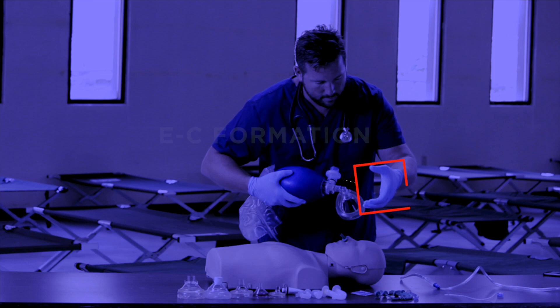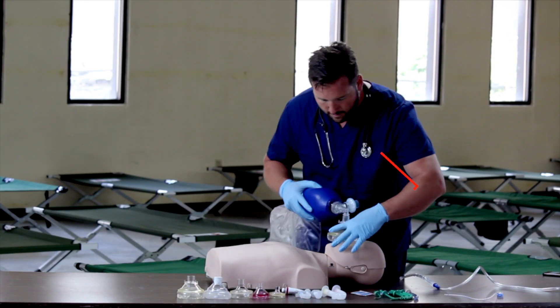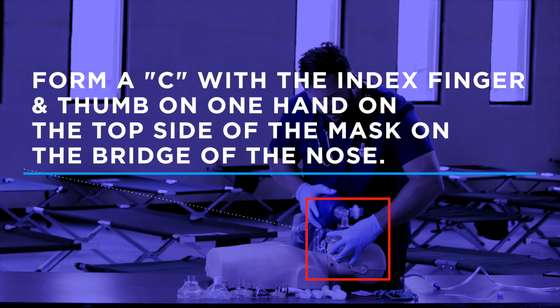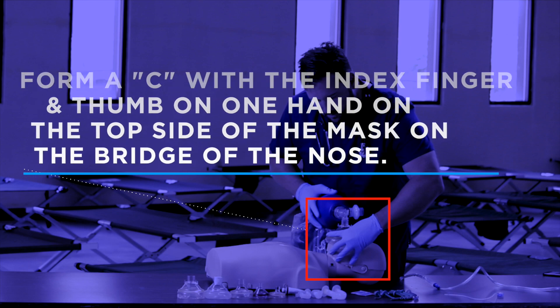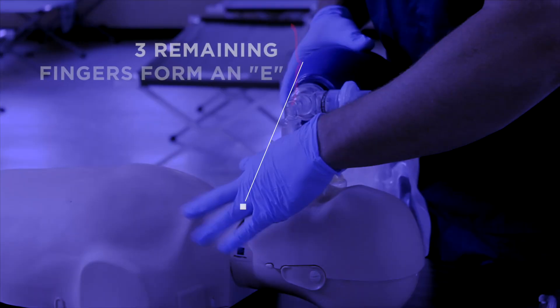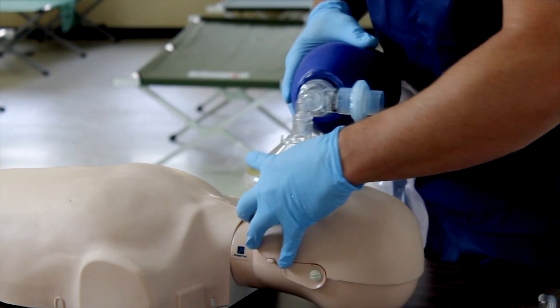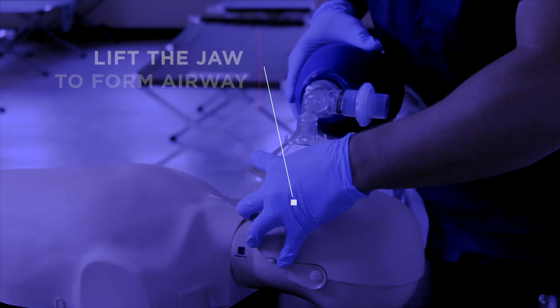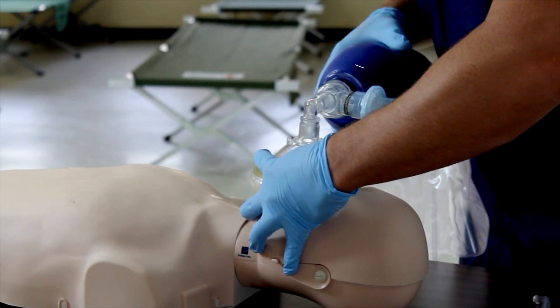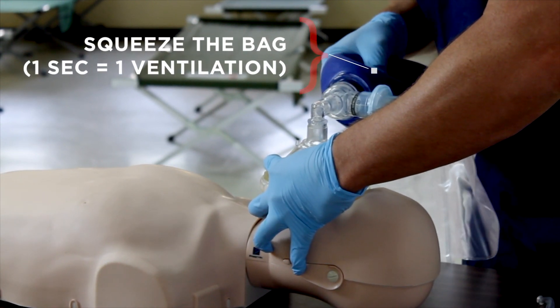To properly use the bag mask, use the EC formation with your hands. Form a C with the index finger and thumb on one hand on the top side of the mask on the bridge of the nose — this securely applies the mask to the face. The three remaining fingers form an E and use these fingers to lift the jaw forming the airway. Maintaining this position, the provider squeezes the bag taking one second to provide one ventilation.